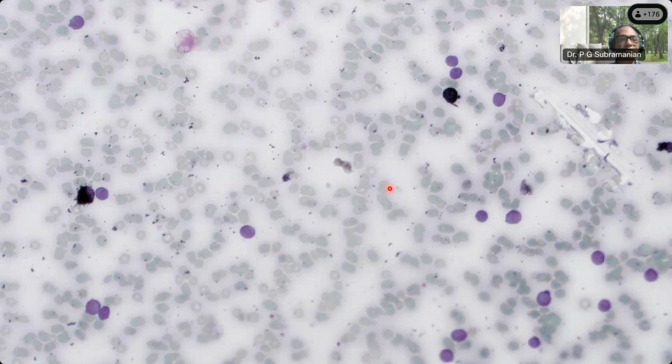Okay, fine. So why do you say it is an MPO stain? There are various methods of doing an MPO, but this is the most traditional method, which has been there for a lot of years. It uses benzidine, but nowadays people try to avoid benzidine because it is carcinogenic, and they use other diaminobenzidine stains.